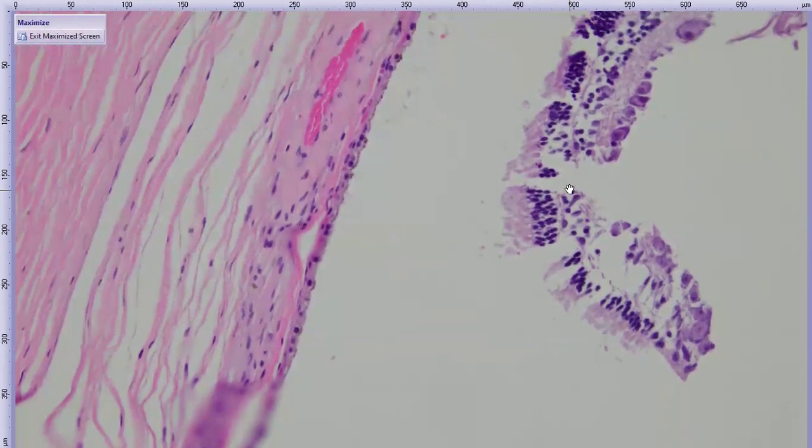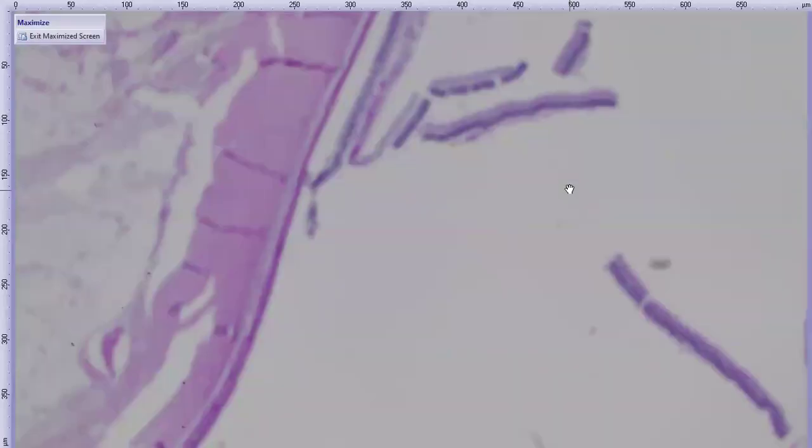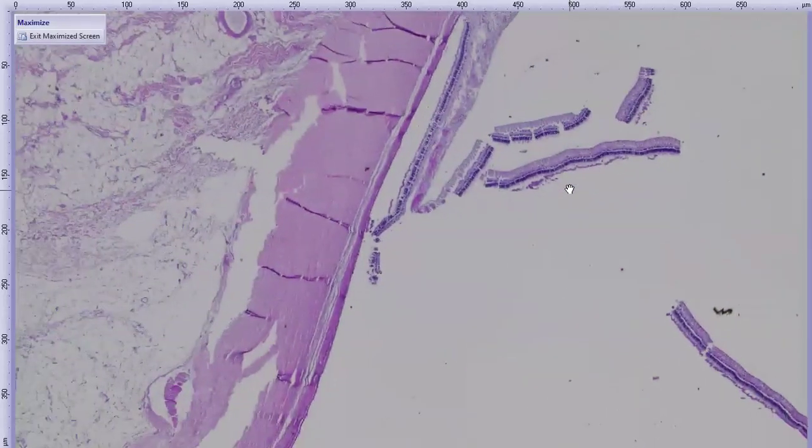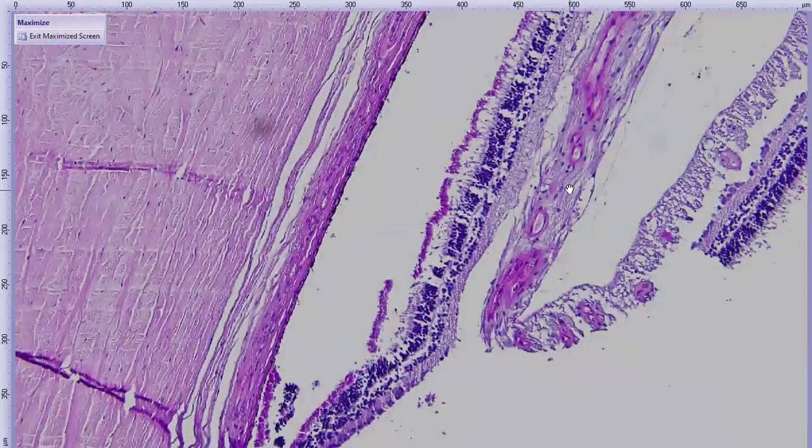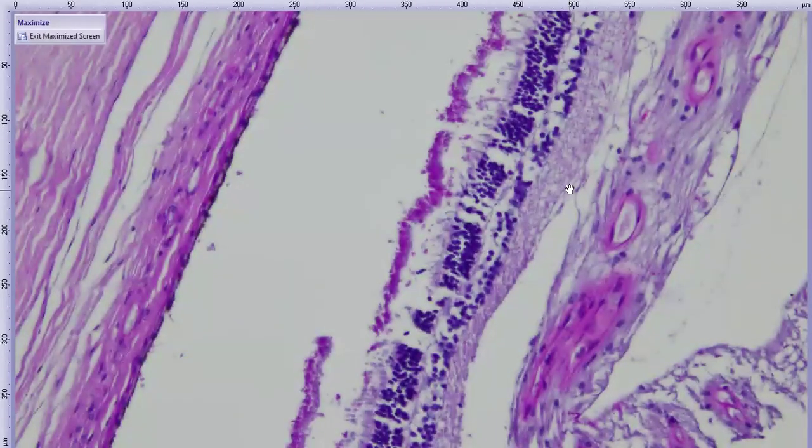So I was curious, given that we have some pigmentary abnormalities in the back of this horse's eye, and did a PAS stain to query what this light brown pigment, especially noticeable in the dorsal RPE, might be. And it's not particularly convincing, but I'll show it to you anyway. The job now is to convince us. I know.